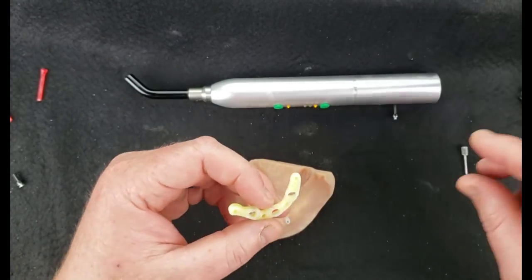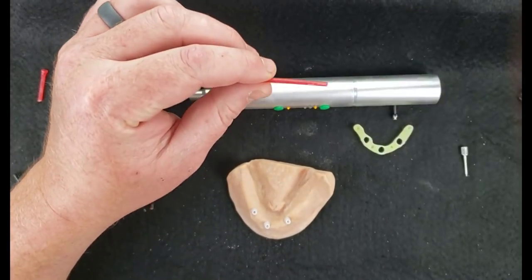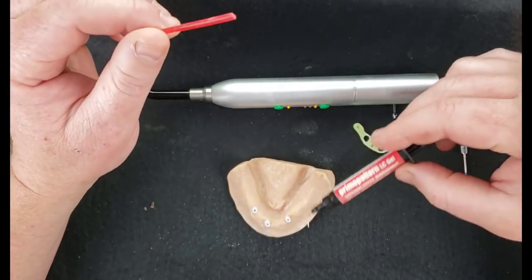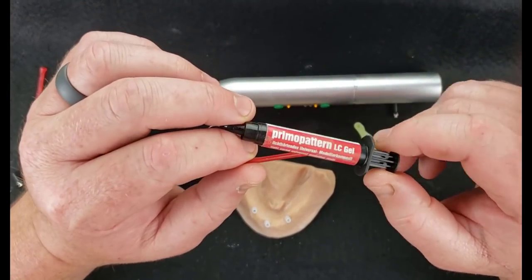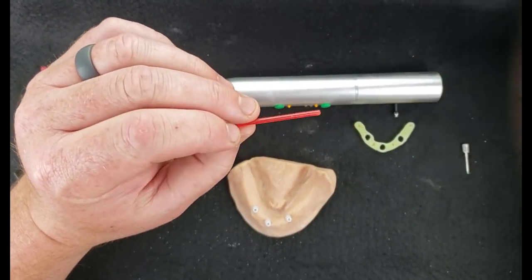If you've got access to a 3D printer, then do that. If you don't, then I would suggest getting some of this stuff. This is called Primo pattern, and this is what I'm going to use to pick up the UCLA abutments as well as the cast 2 abutments. It's a castable resin which is light cured, and that light cure makes this a lot more convenient to use than the salt and pepper traditional stuff.